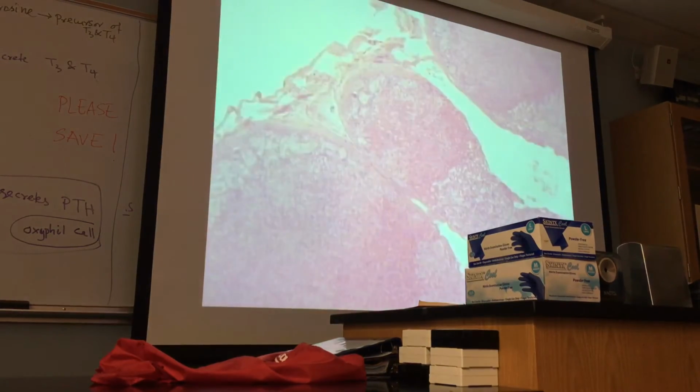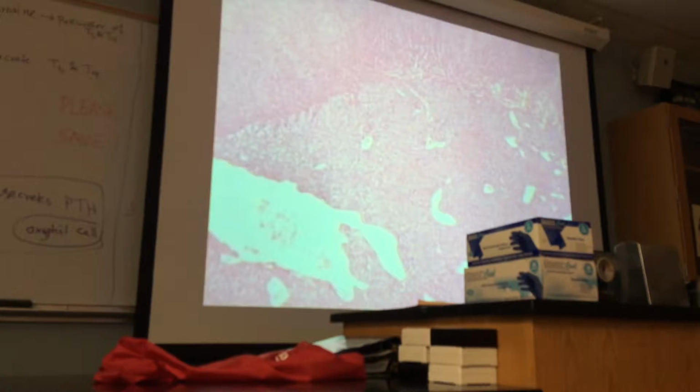And these two parts include adrenal cortex and adrenal medulla. On the basis of staining, do you find a difference in staining property of this part and this part? Which part is lighter? The bottom. So any soft organ, when you make a section, what do you call the central part? The medulla. And what is the outer part? Cortex. So we have adrenal cortex, adrenal medulla.